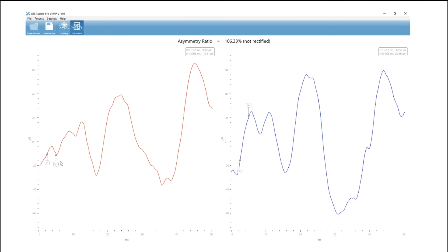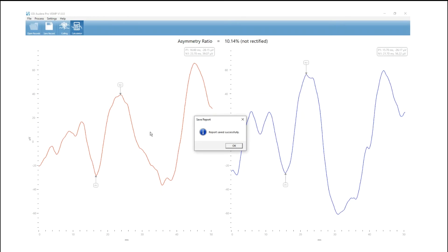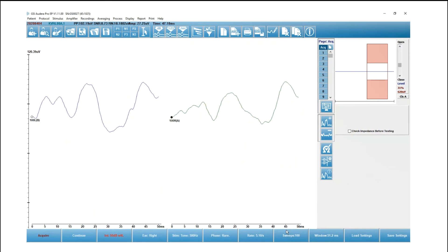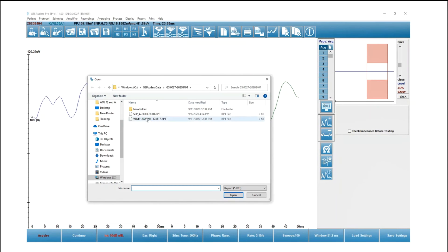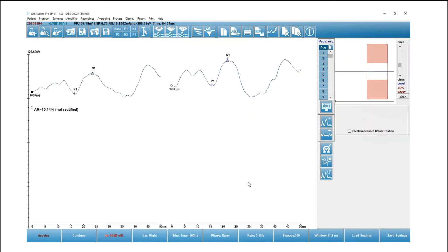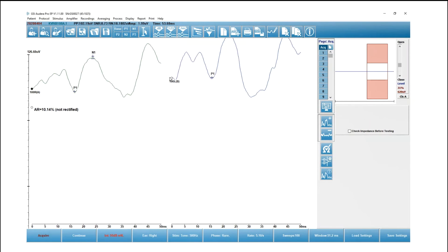Now I'm in the calculation screen, which is the default, and I have to mark my N1 and P1 for both waveforms. While you're doing that, you can see the asymmetry ratio is automatically updated as you move your markers. You can view the P1N1 latency as well as the amplitude relative to zero. Once I'm done marking, I'm going to save that record, then return to the EP module and load my report. When you load a report, it will store the displayed data. Here are the marked waveforms that came over from the VEMP module.